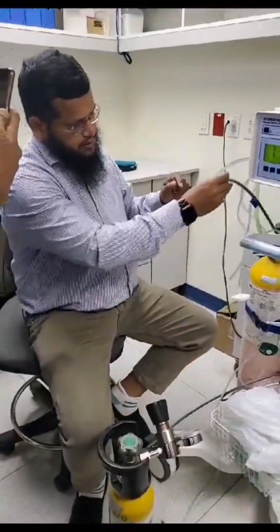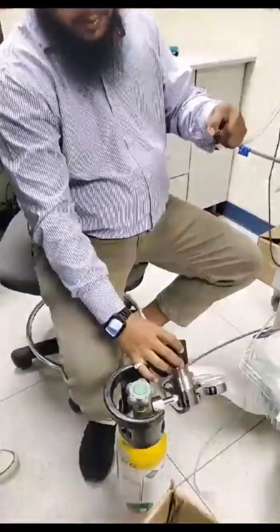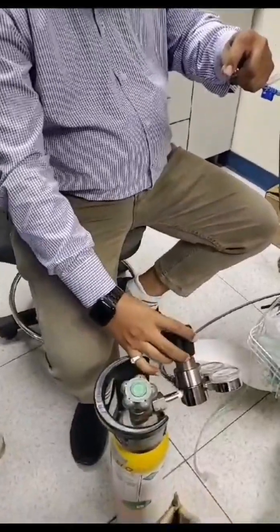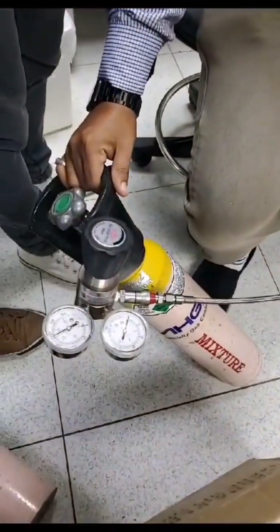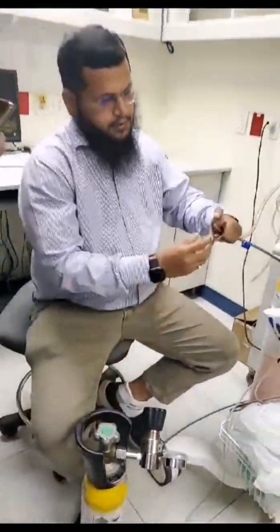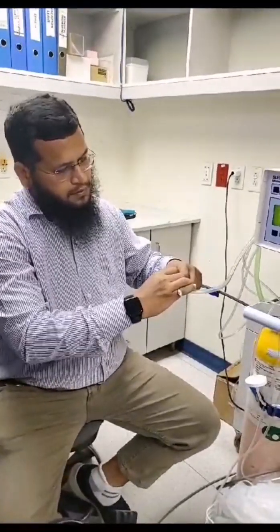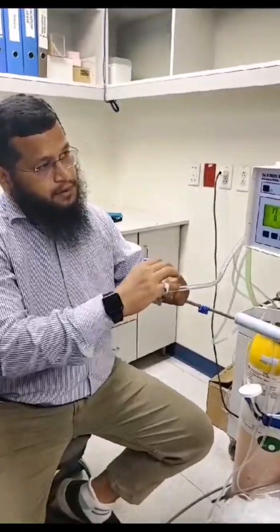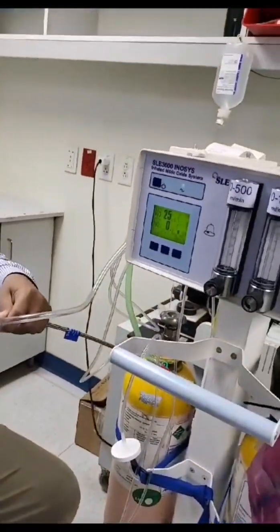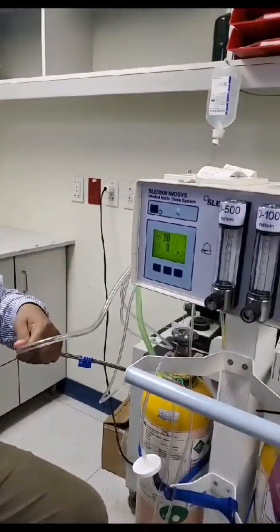The calibrated gas will tell our machine to show us the same value. So before we connect, we will open the regulator very slowly — not with high pressure. You can see the gauge; it's very low pressure. So we will connect this gas and wait for the reading. It should show us the same value as what is mentioned on the cylinder. We will wait for at least one minute to stabilize the value.